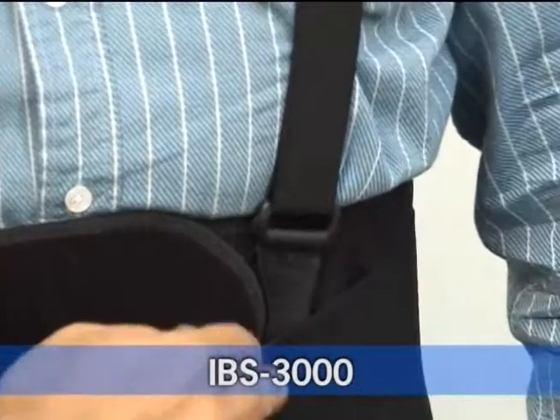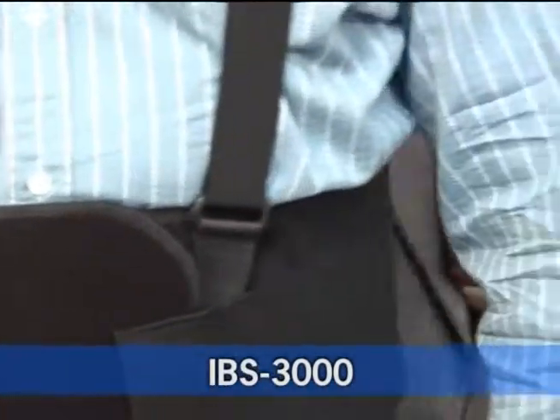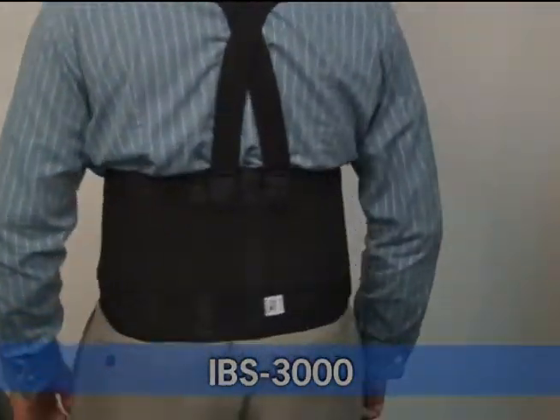Make sure the belt is firmly attached using the adjustable side pulls. Next, attach the one and a half inch suspenders to the front of the belt. Our work belts provide excellent support and comfort in the lumbosacral area and they help reduce lower back pain and offer protection from injury.